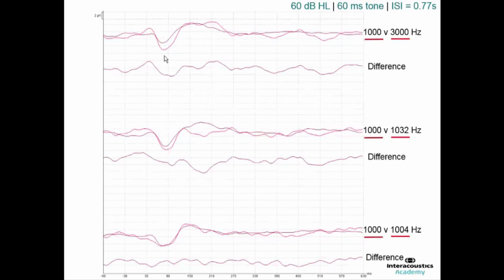Now, once again, I'd just like to hit upon that point about the difference in the ALR amplitude. So, in this set of examples, we're reading again from top to bottom, and the standard and the deviant difference is getting progressively smaller. So we've got a very easy discrimination task here, because there's a big difference between standard and deviant. And what I'm most interested in is, well, firstly we have the MMN occurring very early, because there's a large difference between standard and deviant, but there's also a large difference between the ALRs to the two sounds as well.